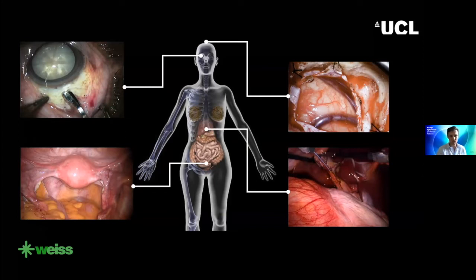So these are just some examples of the type of anatomy that might be observed by a range of cameras during surgery. And as one can see, there's quite a lot of variability, and that's due to the shape and the photometric appearance of the anatomy and of the organs, but also a variety of instruments, magnification types, and so on. So the type of data that we're capturing is quite diverse.